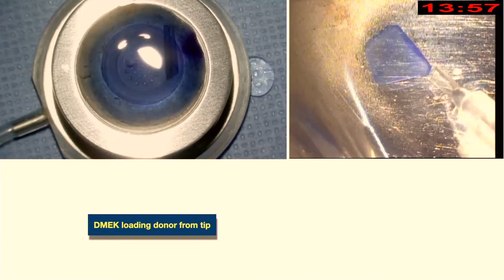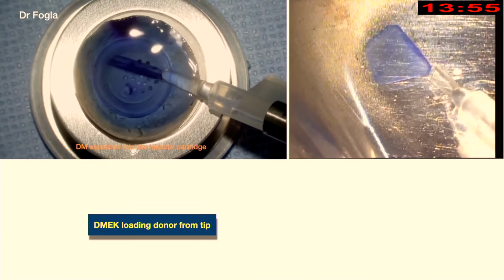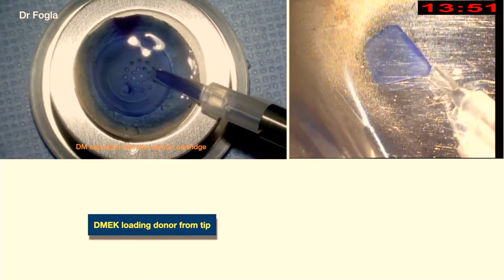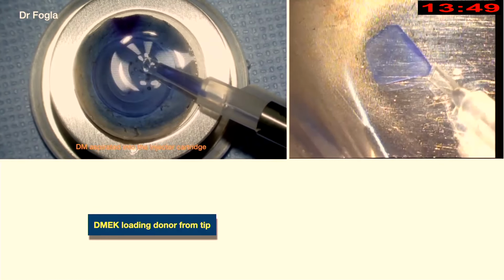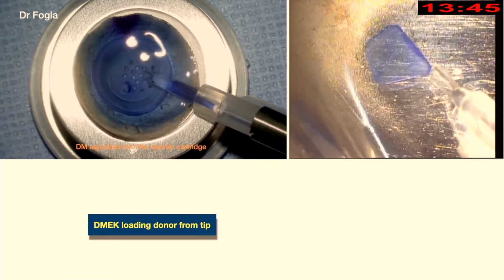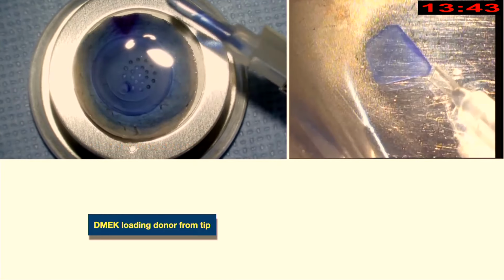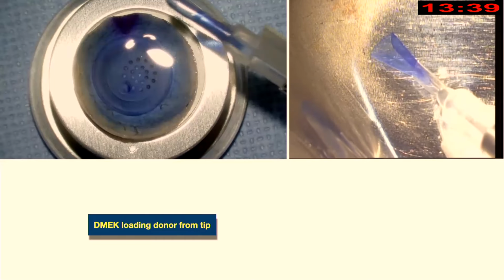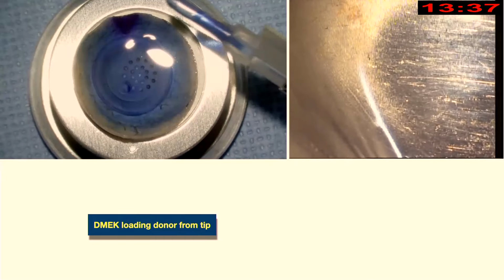So when you load the donor, you have prepared the scroll. You can load it directly from the corneoscleral rim. But remember, you have to ask your nurse to keep replenishing the fluid, otherwise you run out of fluid and your scroll has not yet gone into the cartridge. Or you can transfer the DM scroll into a bowl and then aspirate. You have an adequate amount of fluid.